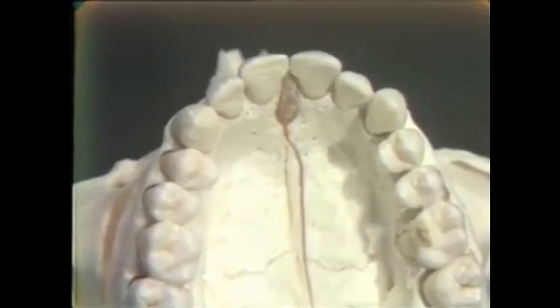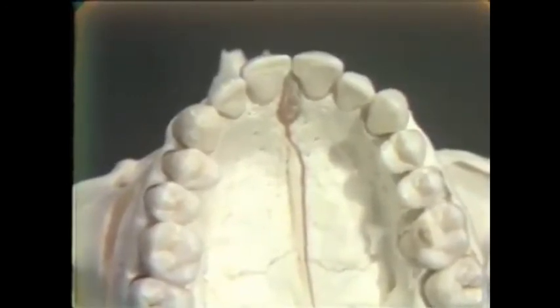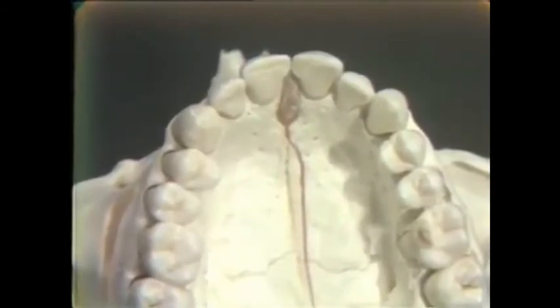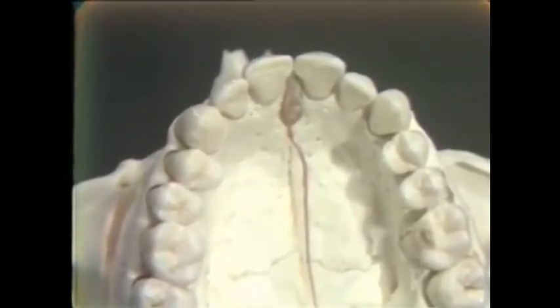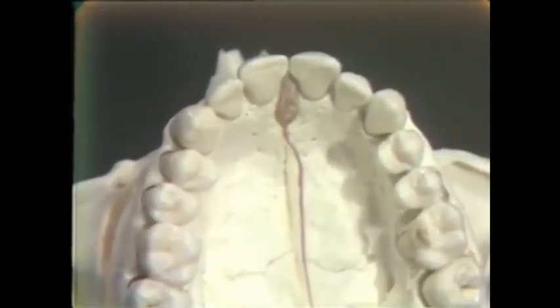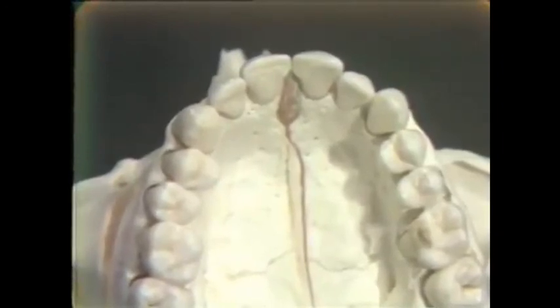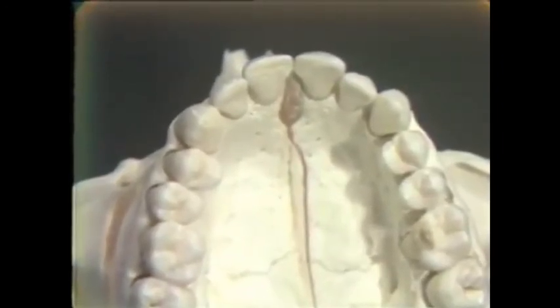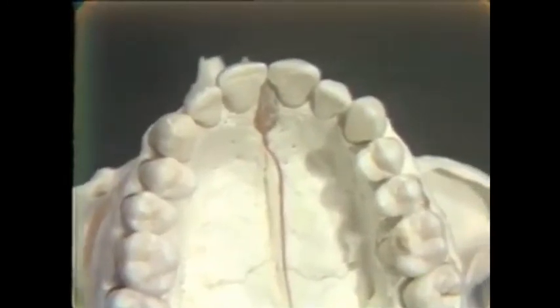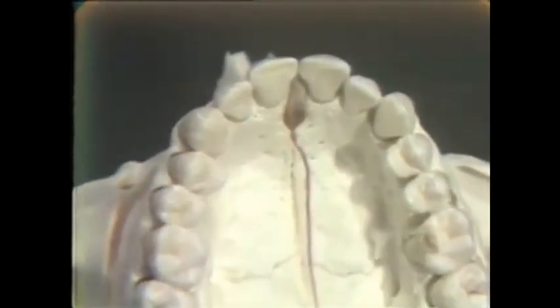As you look in the mouth, you will see that there is a papilla that overlies the incisive foramen directly over it, and we wish to avoid injecting directly into it since it is extremely sensitive. So we find that it's adequate to make the injection on either side of the foramen or the papilla, and we can very adequately anesthetize the terminal filaments of the nasopalatine nerve.